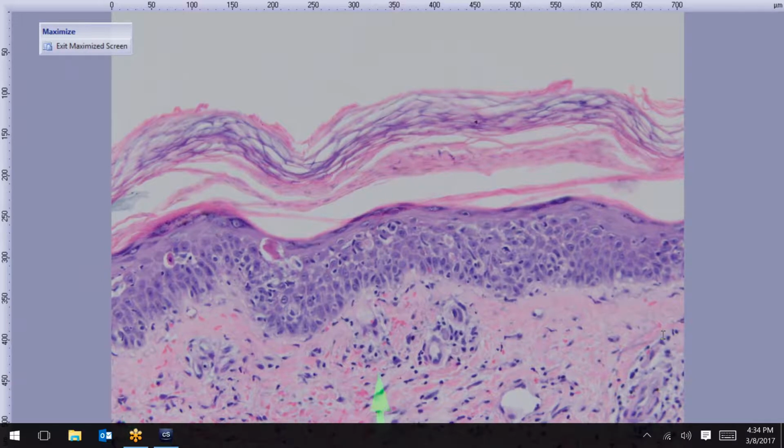Good comments. Okay, good. All right, let me look at your comments here. Okay, yep. So interface dermatitis, and that's correct. All these things are on the differential. So erythema multiforme, acute graft versus host disease is on the differential.